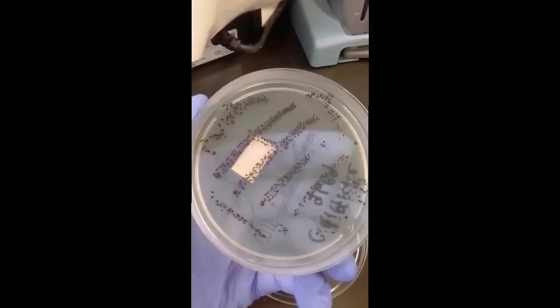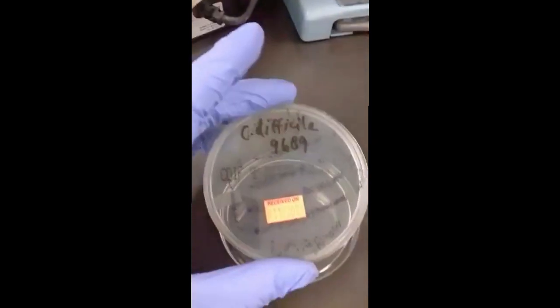For example, you have your C. diff plate, you're going to want to see your Clostridium difficile growing on that. You have your BCYE plate, you're going to want to make sure your Legionella is growing on that, and if it's not, then either your bug is non-viable and you need to rehydrate your bug, or the plate is non-viable and you're going to want to get a new lot or a new batch of your BCYE plate, for example. So that's why it's important.